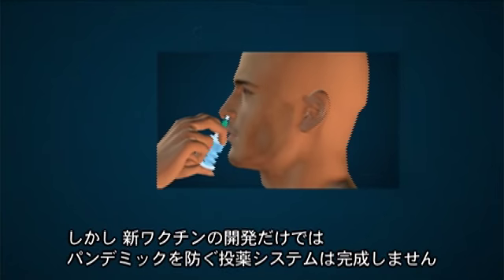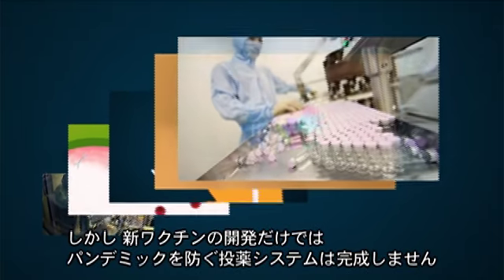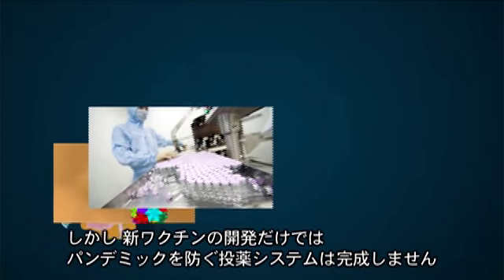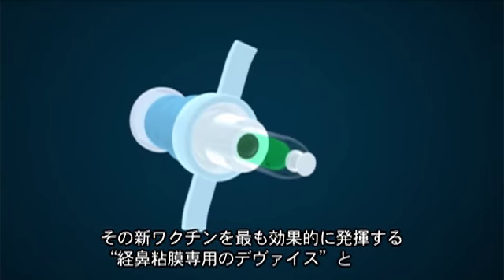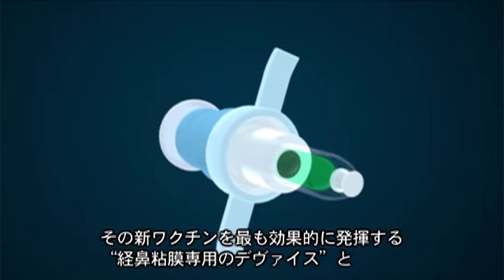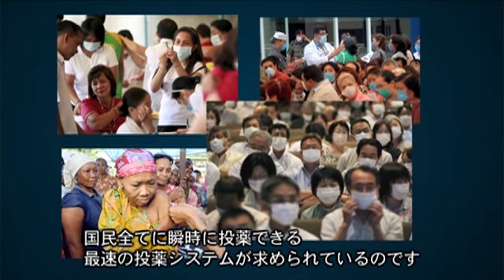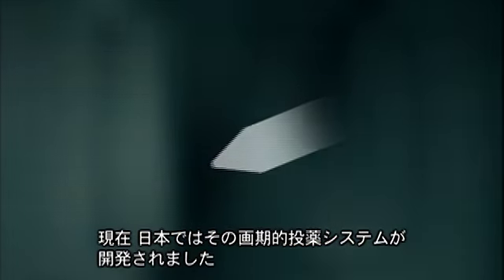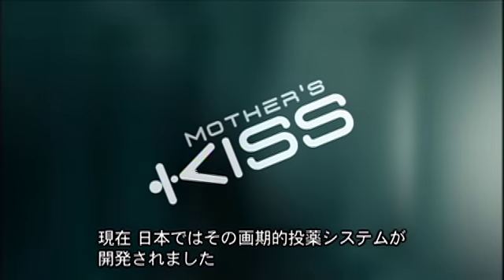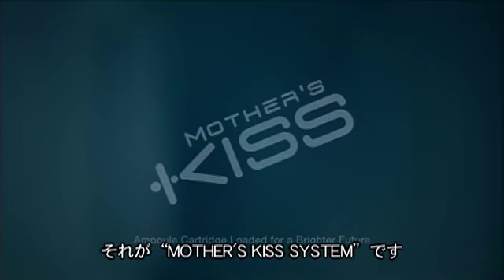A delivery system for pandemic prevention will not be perfected, however, with the development of a new vaccine alone. It would be essential to have an exclusive device for intranasal delivery of the mucosal vaccine to ensure the full effects of the new vaccine and to have a high-speed delivery system to inoculate all citizens immediately. An innovative delivery system has already been developed in Japan. This is the Mother's Kiss system.